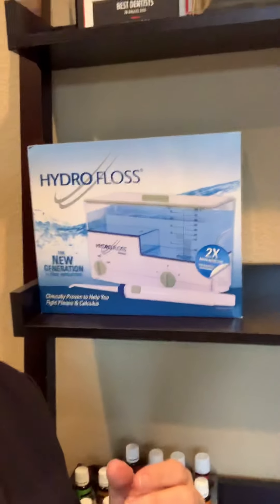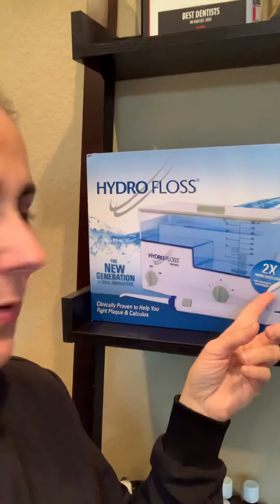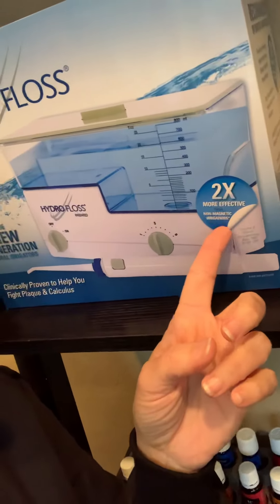Hey, everyone. How are you today? I'm going to talk about something that you may take for granted. I'm at the office today and I had an opportunity to share this, but I have so many people that don't know about this. So I'm going to show you here. This is called a hydrofloss. I want you to see this little thing — what does it say? It says two times more effective than non-magnetic irrigators.